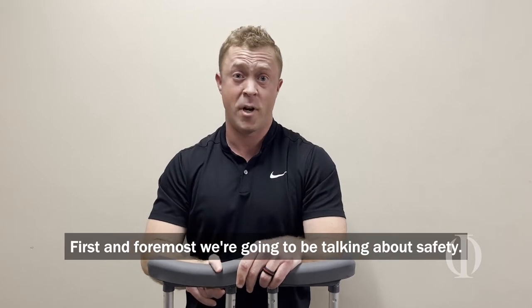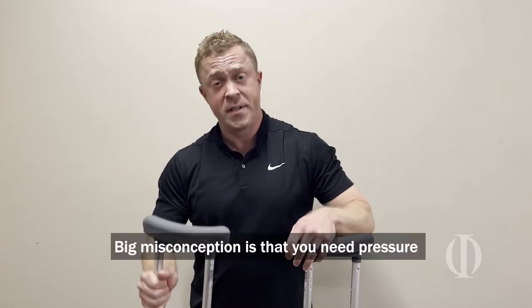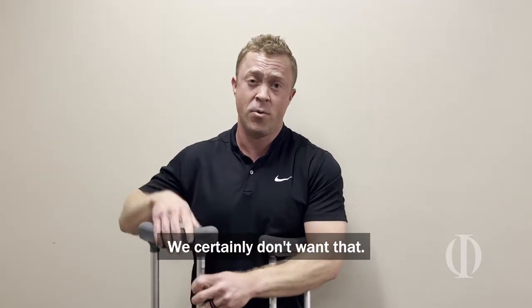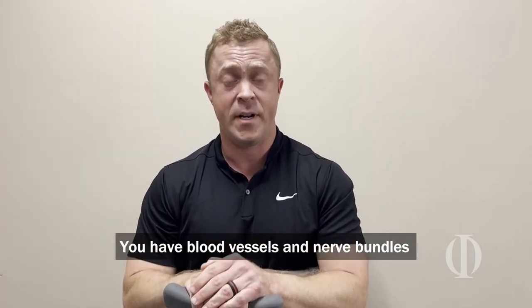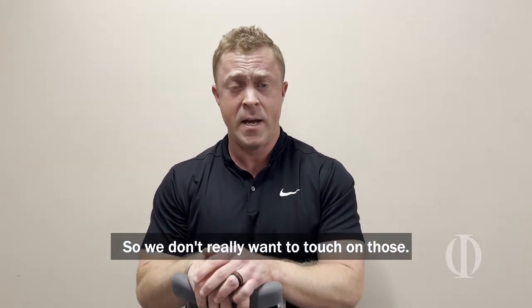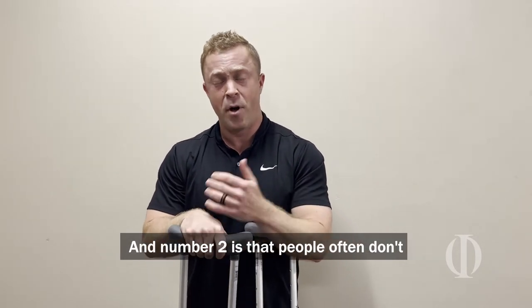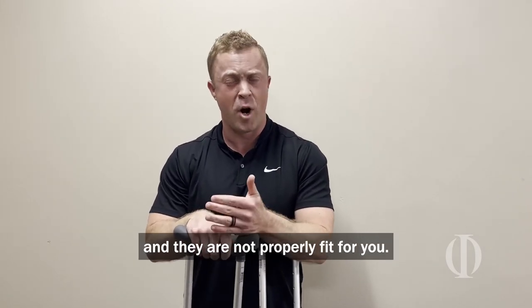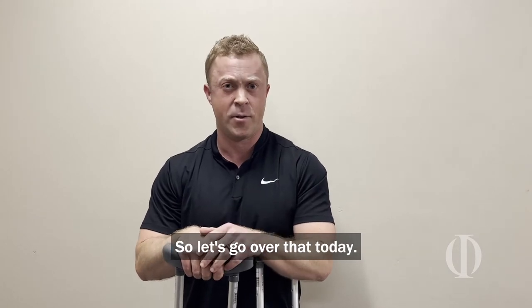First and foremost, we're going to talk about safety. A big misconception is that you need pressure in your armpit with the crutches for it to be stable — we certainly don't want that. You have blood vessels, muscles, and nerve bundles that run there and they're really important, so we don't want to touch on those. Number two is that people often don't get these from a medical office — you often see them from a friend or family member, and they're not properly fit for you. So let's go over that today.